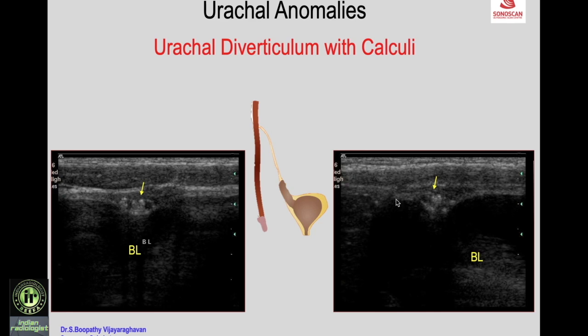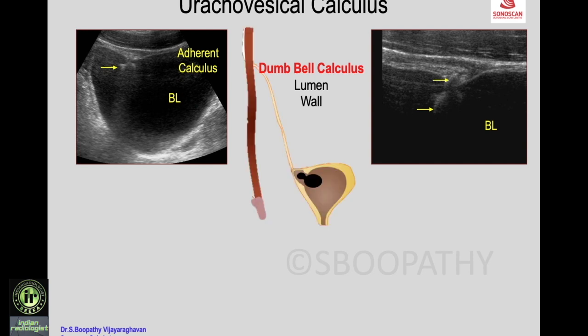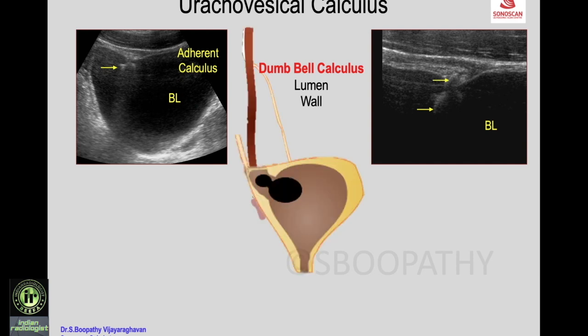A patient presenting with hematuria shows on scan a calculus adherent to the dome of the urinary bladder. High-frequency scan shows the bladder wall at the dome with a calculus in the lumen continuous with part of the calculus within the urachal diverticulum — forming a dumbbell-shaped calculus partly in the lumen and partly in the wall of the bladder. This is the uracovesical calculus.